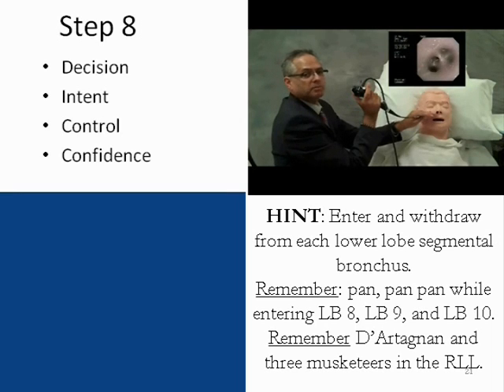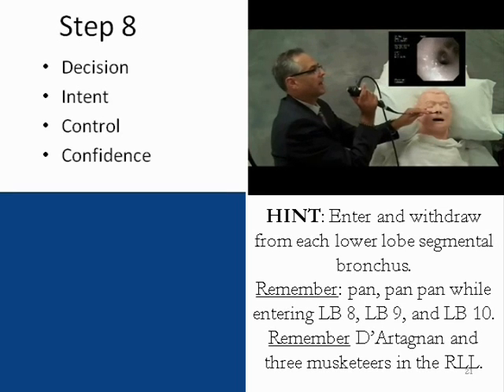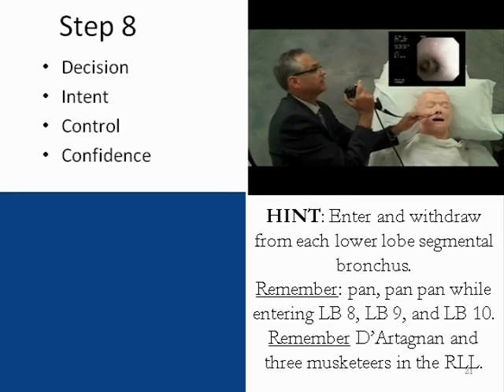Analogous to moving from one parking spot into another, it's important to not cross the midline. We must enter the segment and pull back. Enter the segment, pull back. Eventually, with practice, you will be able to enter each segment more quickly and without traumatizing the spurs of these segmental bronchi.